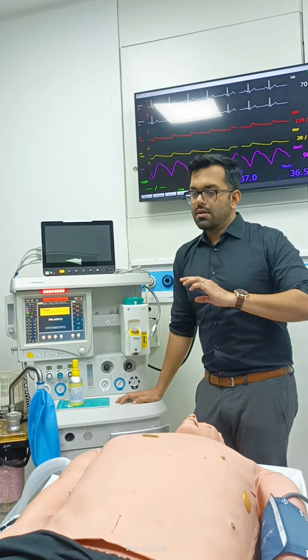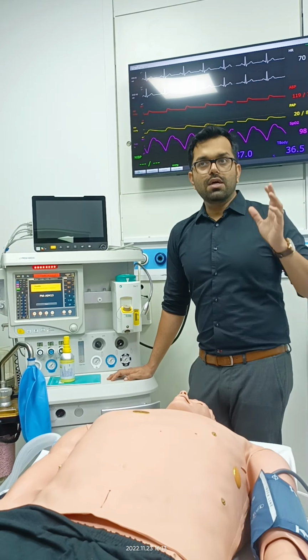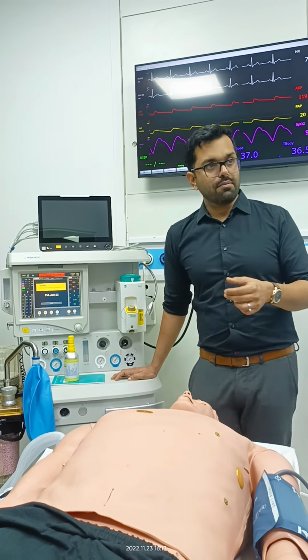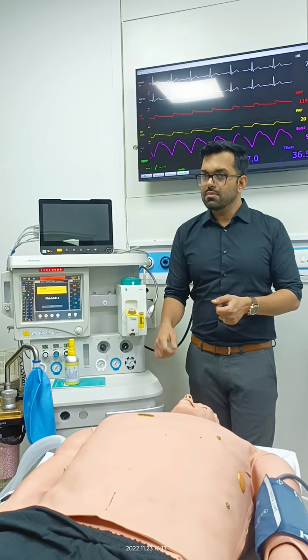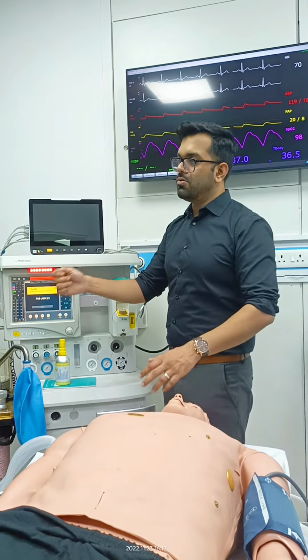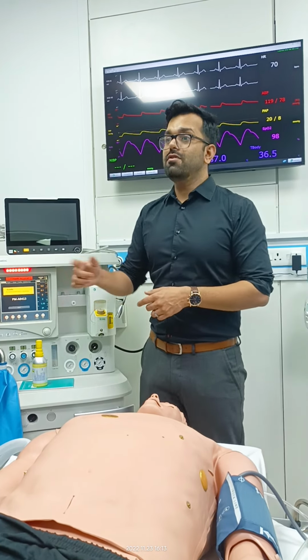Now surgery is going on, maintenance of anesthesia is going on. After 1.5 hours, it was a case of laparoscopic appendectomy. Surgeons took out the appendix, now they are doing closure. While they are closing the abdomen, they come up to skin. Now is the time that we have to prepare for reversal of anesthesia.